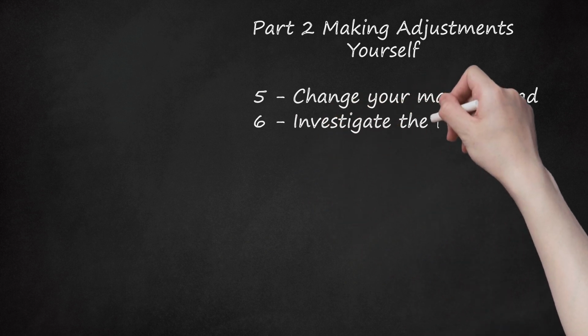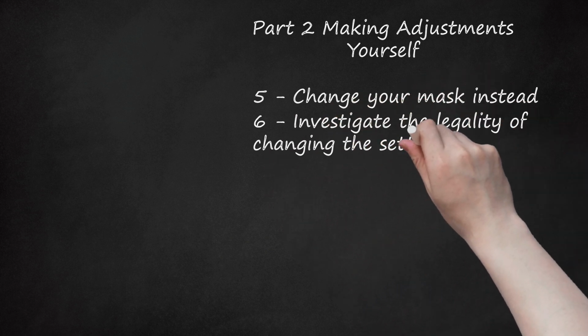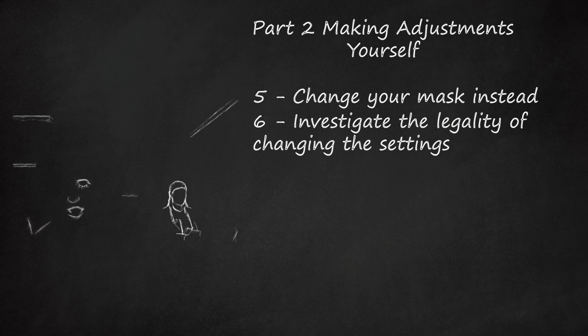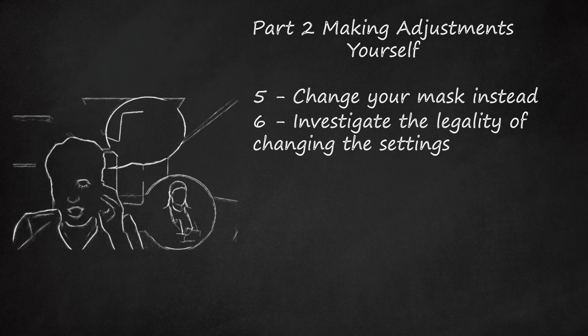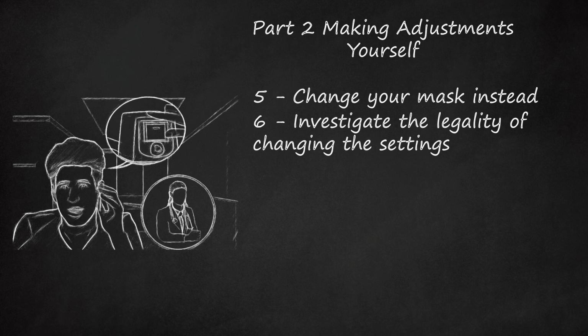6. Investigate the legality of changing the settings. It appears that changing your CPAP settings requires a prescription from your doctor because the machines are classified as Class 2 medical devices. As such, changing the settings requires a physician's oversight either directly, in person, or indirectly, via a faxed prescription. This gives you two options: going to your doctor's office with your machine, or calling the physician and getting them to fax the prescription, with the changed settings, to the medical equipment company.